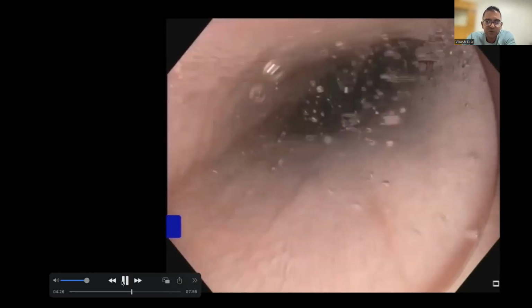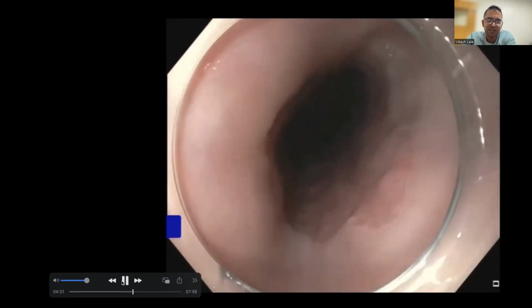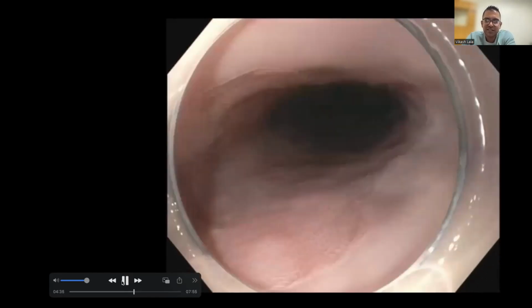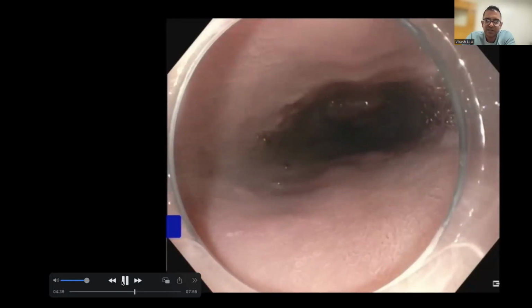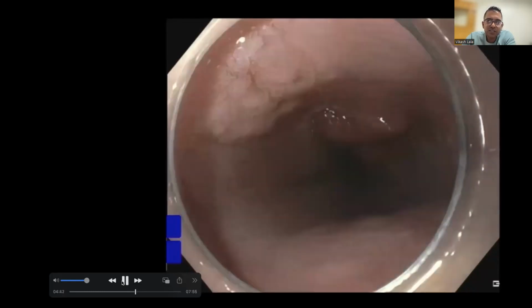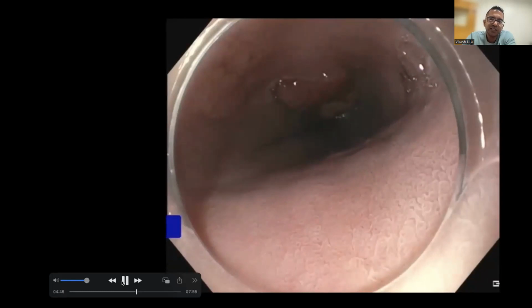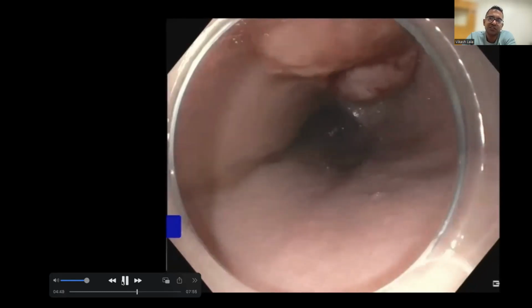Just be careful that all of these Barrett's patients, by definition, are going to be metabolic syndrome. They're likely going to have obstructive sleep apnea, and they're not going to tolerate unsedated gastroscopies, and a lot of them will require intubation. So remember, when you're doing acetic acid, what you're looking for is early loss of acetowhitening. So you do actually have to wait a couple of seconds to appreciate early loss of acetowhitening.